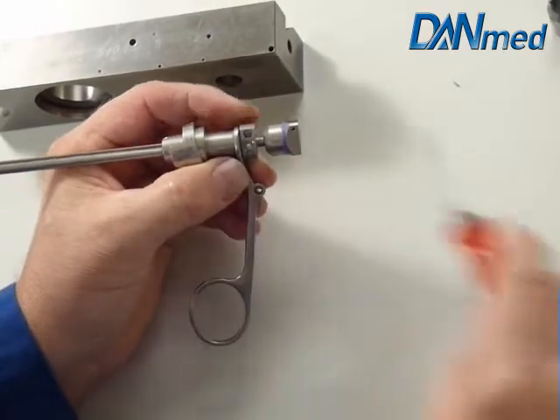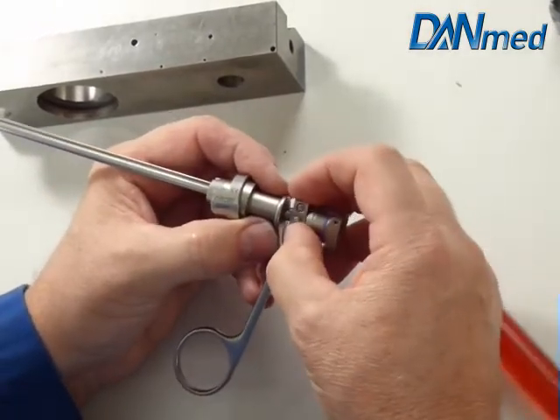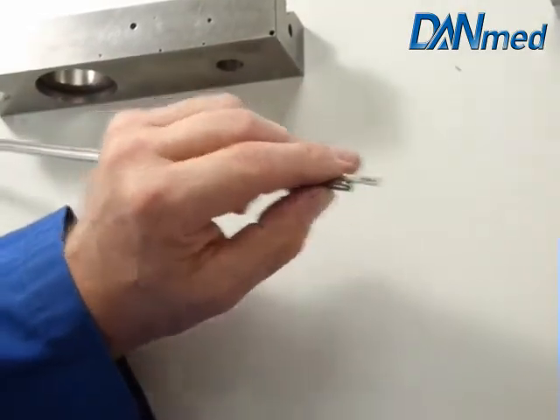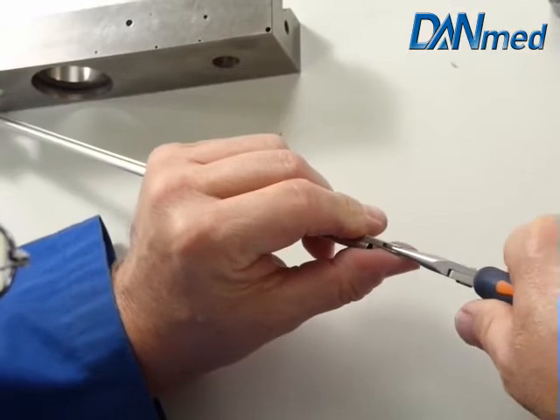We open the screw on the end of the inner stem so the inner stem is now loose. Pull the inner stem out.